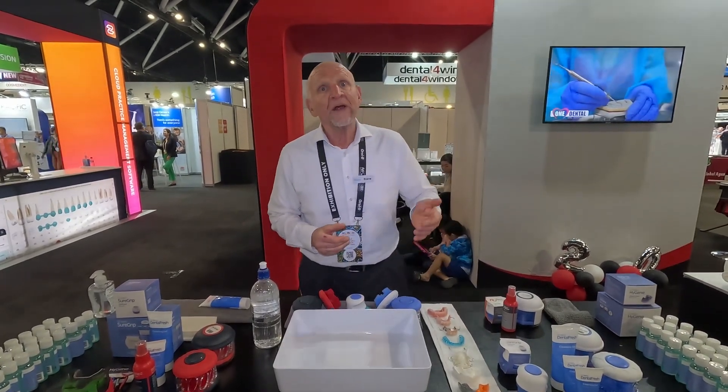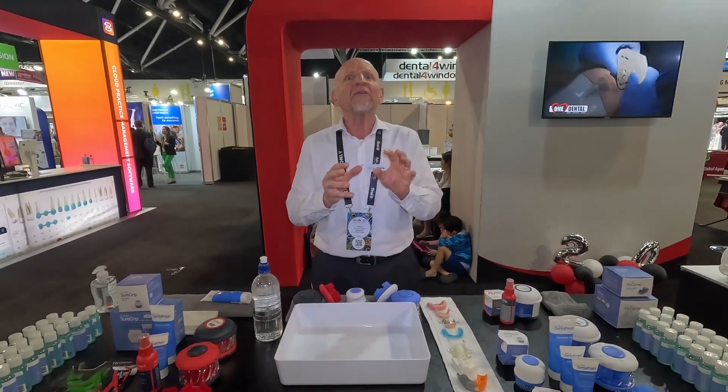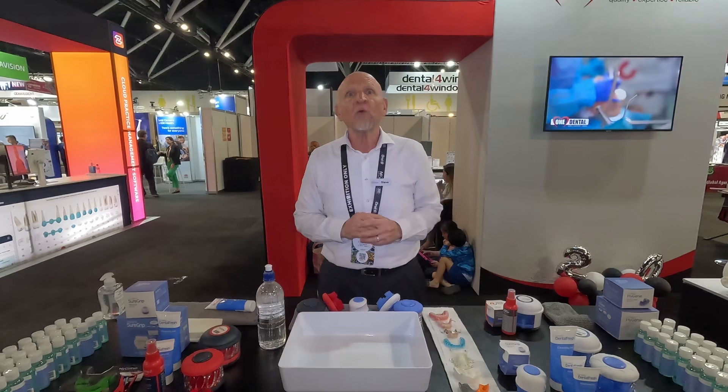Dentures — full and partial — night guards, splints, orthodontic retainers, mouth guards: anything that goes in and out of the mouth temporarily is quickly, effectively, and safely cleaned, stored, and protected with the HyGenie product range.